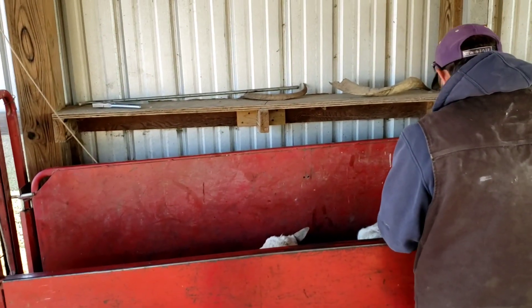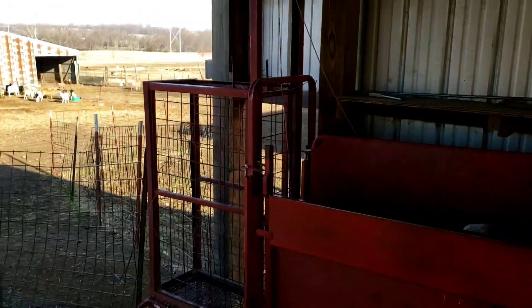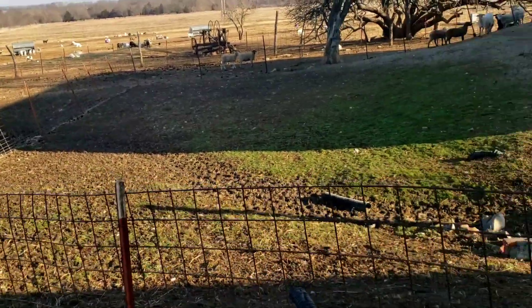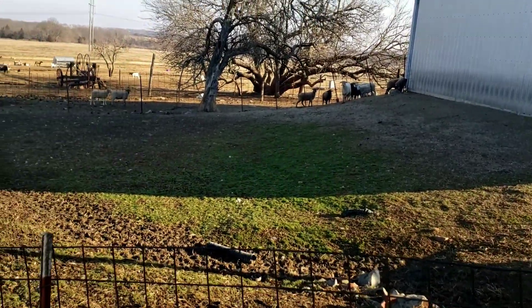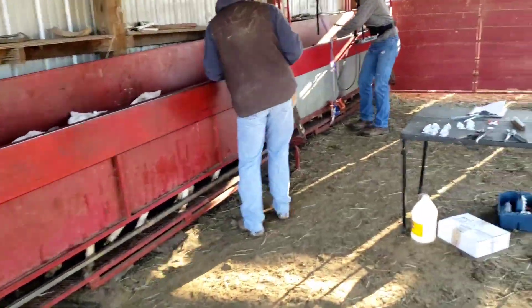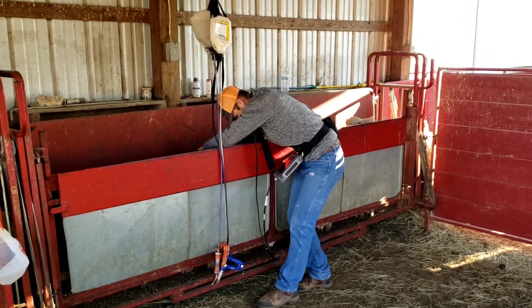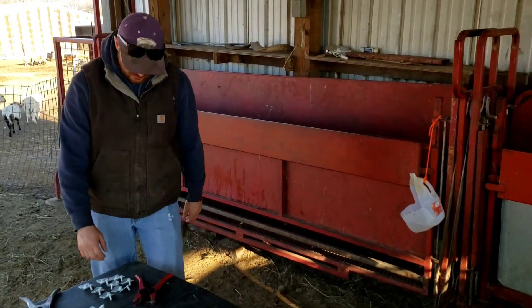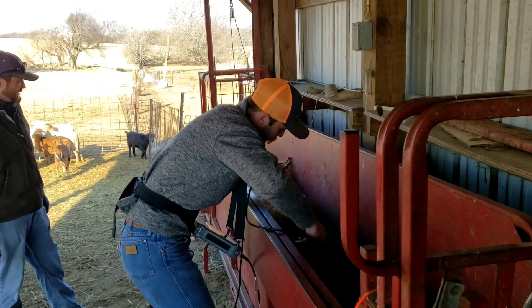Today we're pregnancy sonogramming these ewe lambs - there's 250 or 260 of them so far. We've had one that looks like it's not open, and there's some others in the alleyway back there we did yesterday. We're using the Reproscan Flex and it really has a nice picture.